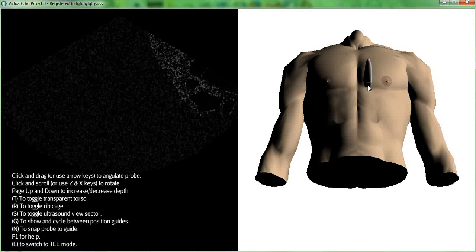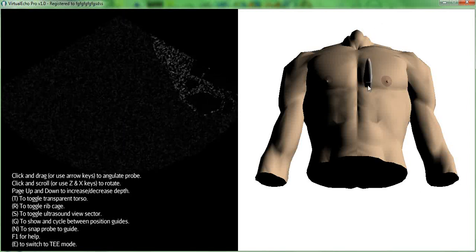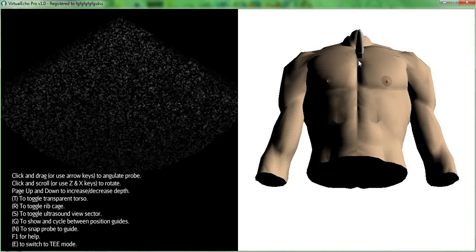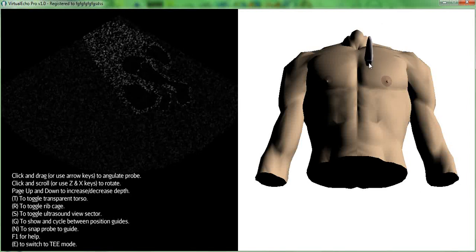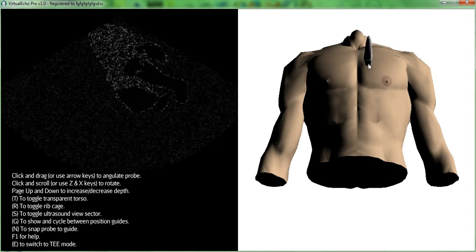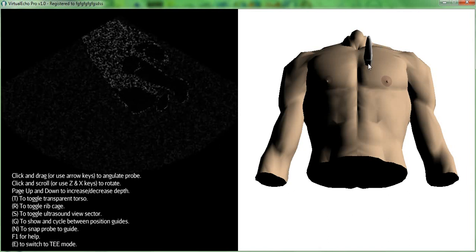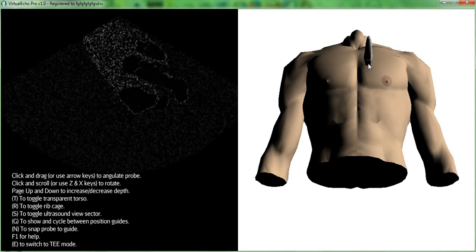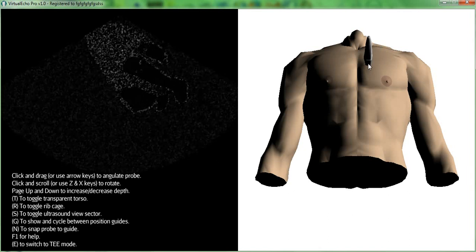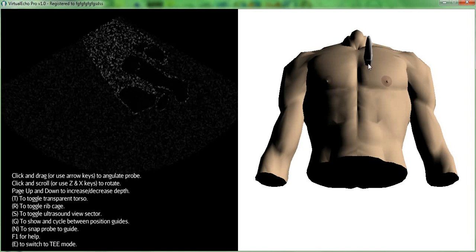Hi! Welcome to Virtual Echo Pro. Virtual Echo Pro is the same as the standard Virtual Echo in addition to a transesophageal module.